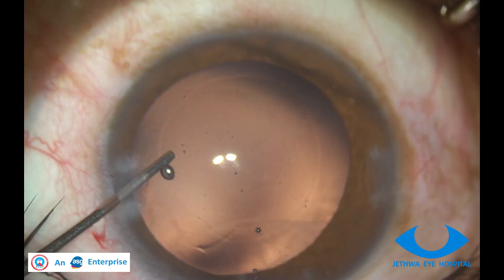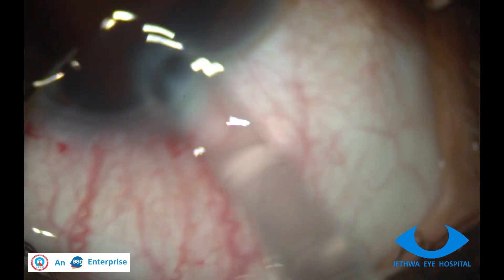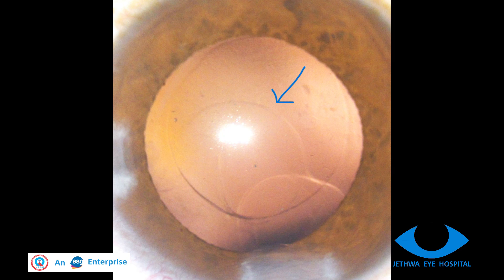A good FACO is done and I'm trying to implant a single-piece IOL, but a T4 cartridge made PCR.